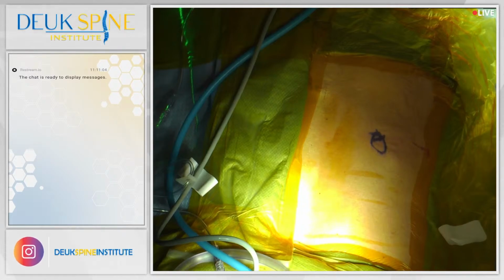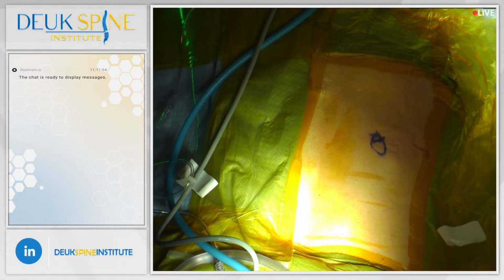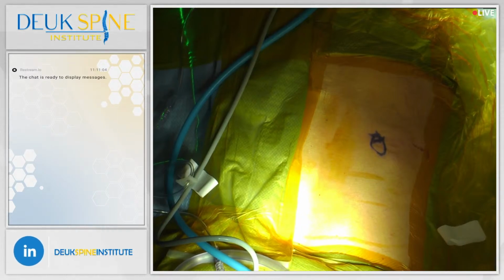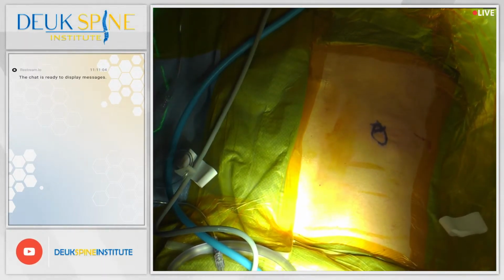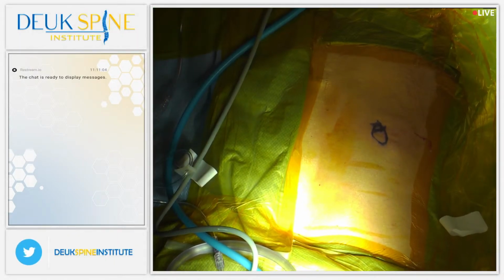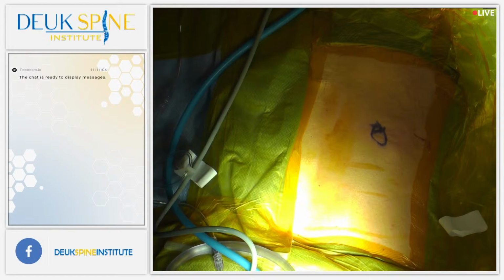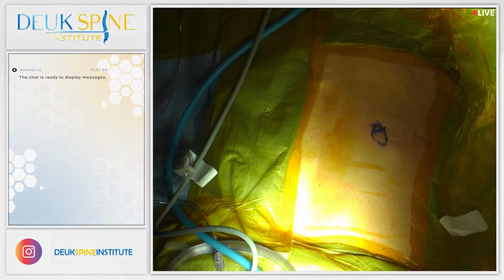February 10th, 2026. I'm Dr. Deukmedjian, and we are getting ready to perform endoscopic transforaminal lumbar surgery in a patient who traveled here all the way from Canada. He's here with his father-in-law, and he's here because he has a herniated disc at L4-5, disc herniation with an annular tear.